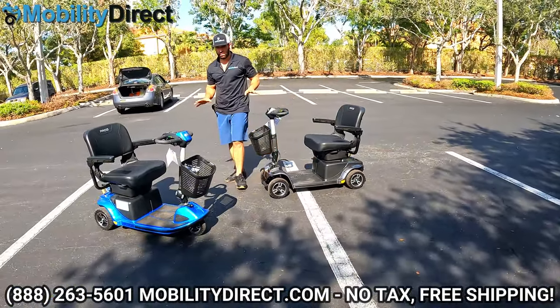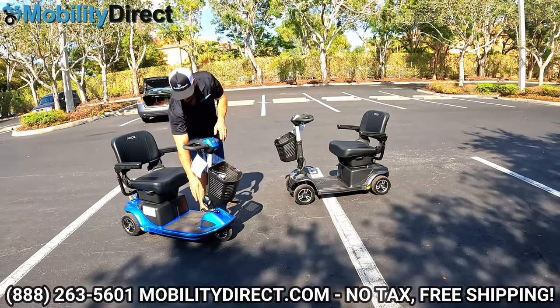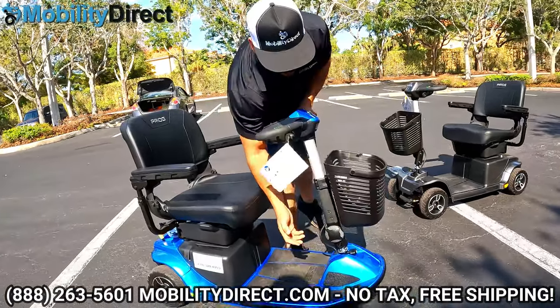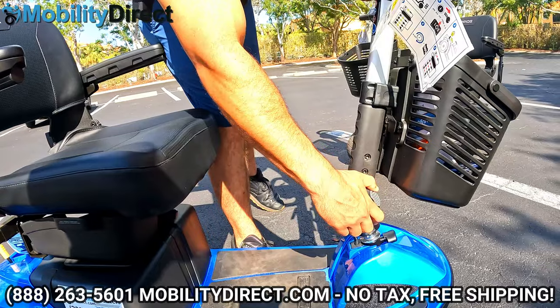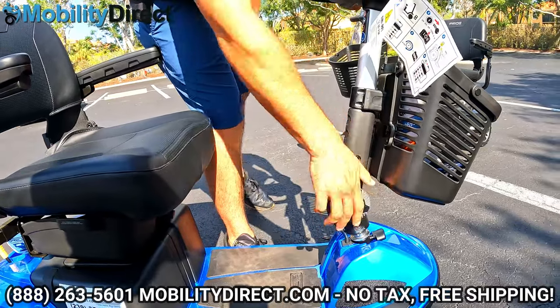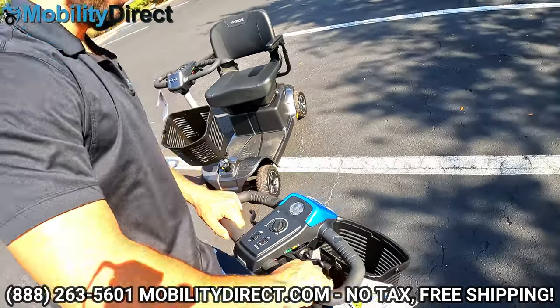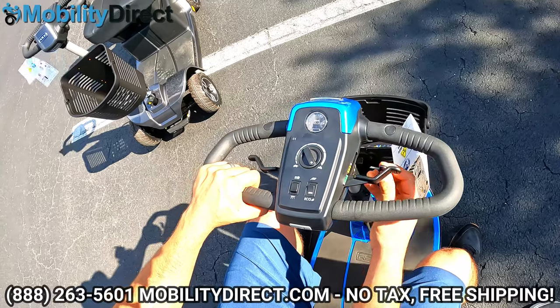Keep in mind both models have the same comfort adjustment features. Here's that rotation knob you can use to tilt the handlebar assembly closer or further away from your body. Let's take a look at the dash. This is a Delta Tiller — it's a wrap-around tiller, very easy to control. You can drive it with one hand. The key is right here and it comes with two keys.